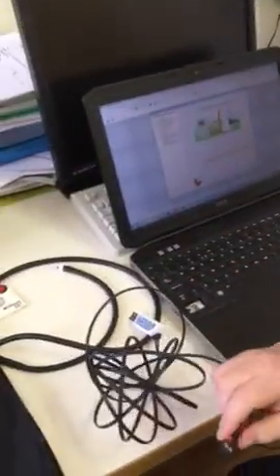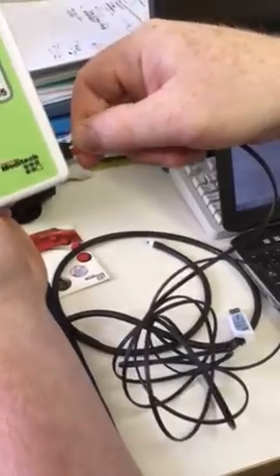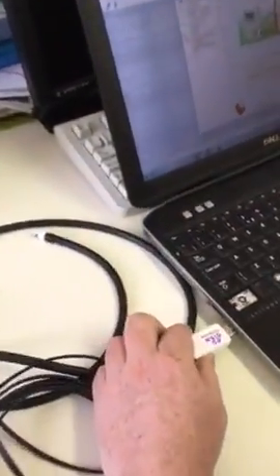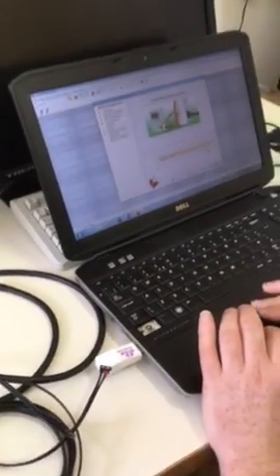Now this is the important bit. Here is the box. We're going to attach this box to the computer or your PC. The most important thing is the red goes on the bottom. Click. Then this USB feeds into your computer, your laptop, whichever you use. Then you just click next and this will automatically sync, okay?